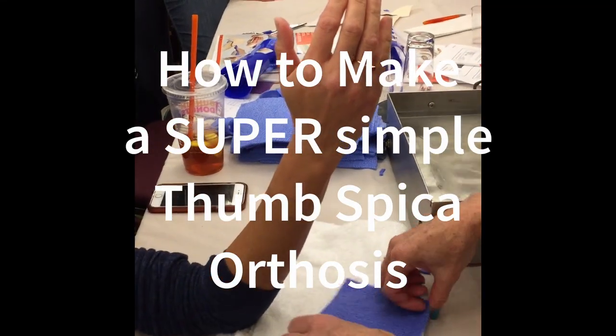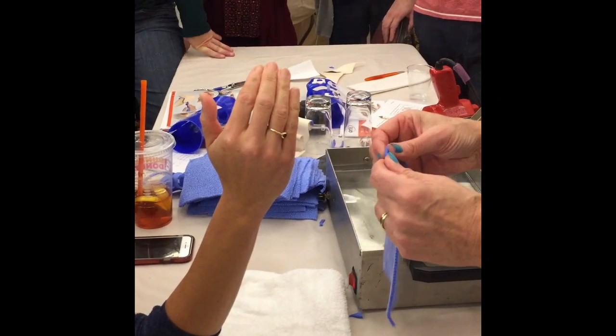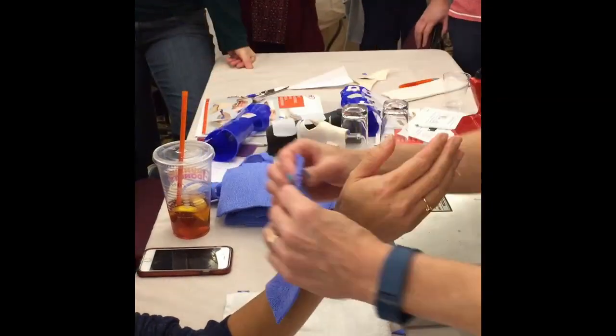Watch this — this is the same kind of principle. We fold the tip so there's a nice fold at the IP joint level.